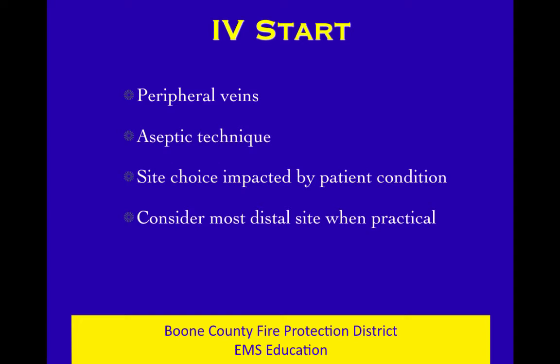On the other hand, if this patient's way sick, we need to get the line way quick. And so your site choice is really impacted by your patient condition. Just think about doing the most distal site that you can get reasonably and practically.